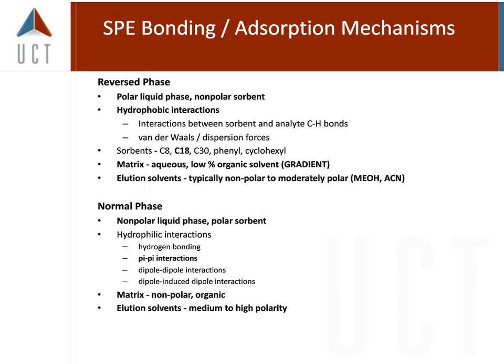But when you start enlarging your groups, benzodiazepines, steroids, a very large group of compounds that are vastly different amongst themselves, to try to say, I want to extract all of my compounds out on one column, that might be difficult. You may be able to extract those compounds, but those that don't have the same efficiency can be increased by using better instrument parameters.